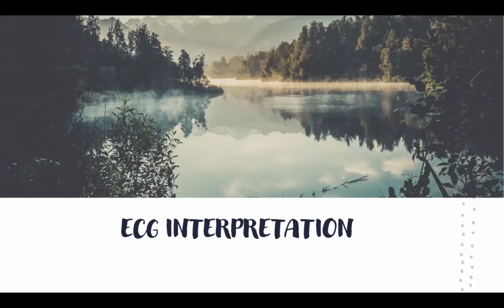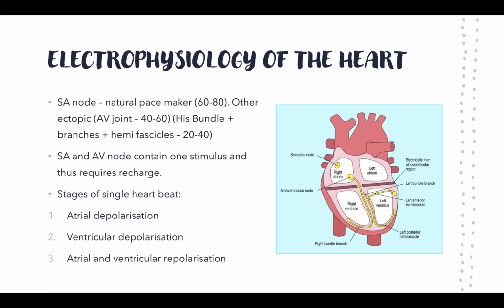So we'll start off with ECG, and I know it can seem intimidating to look at it for the first time, and I certainly did, but it's all about practicing and applying it in different ECGs, and over time, you tend to get better and better at it. So we'll start off with the electrophysiology of the heart.